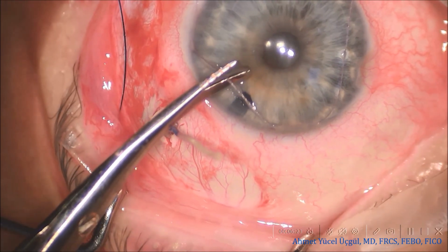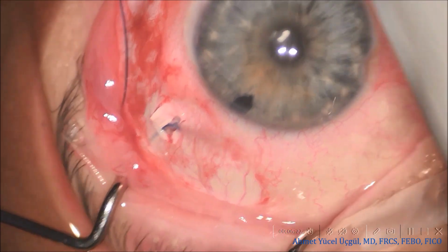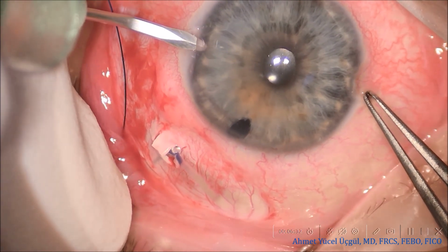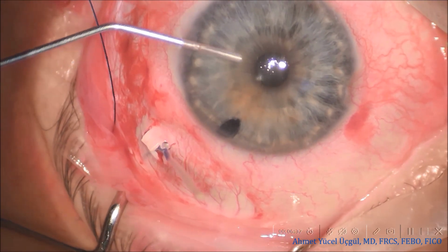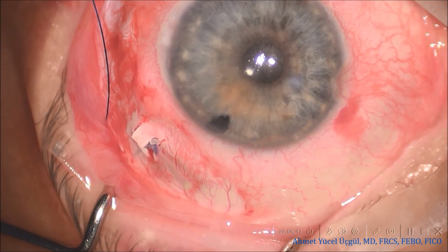When it is time to enter the anterior chamber, the first priority is to bring the globe into a true coaxial position so that the entry is made in a proper horizontal plane. At this stage, the traction suture can be removed. A paracentesis is then created and a small amount of viscoelastic is injected into the anterior chamber to maintain chamber stability after tube entry and to reduce the risk of lens touch.